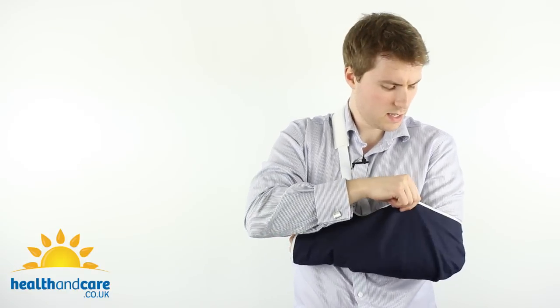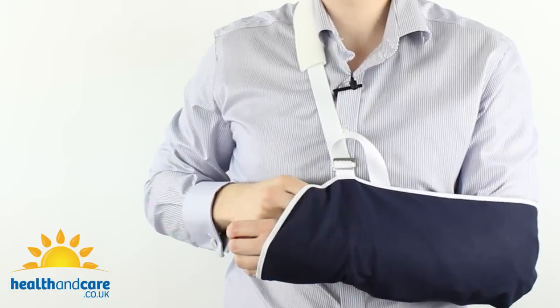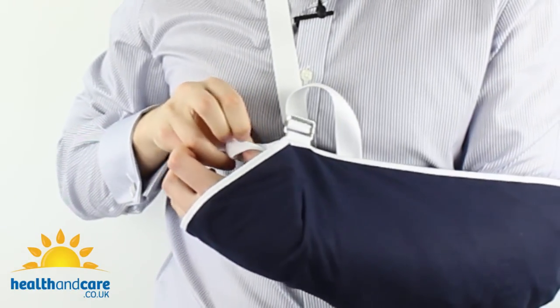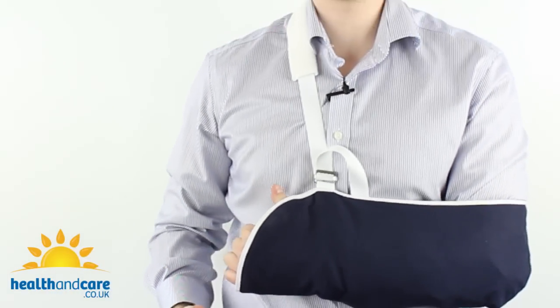As you can see the arm sling is now in place. My elbow is in the corner. You can adjust the material just to make sure it's in the right position. Then simply put your thumb through the thumb loop on the inside of the arm sling and that will keep the arm sling and the material in place.